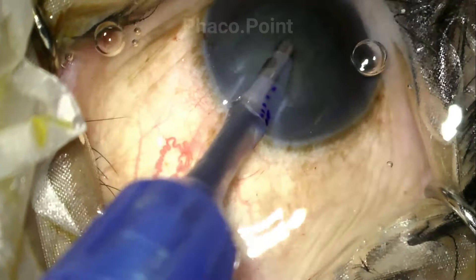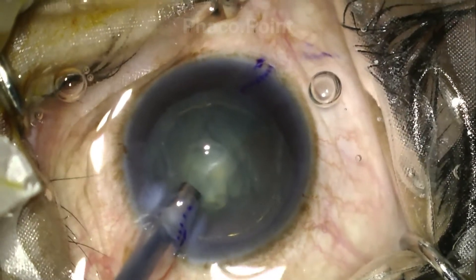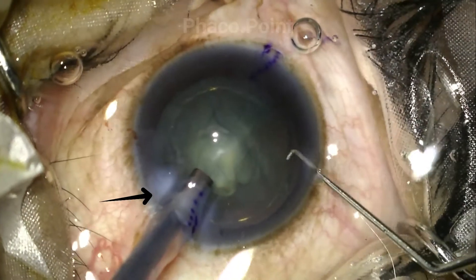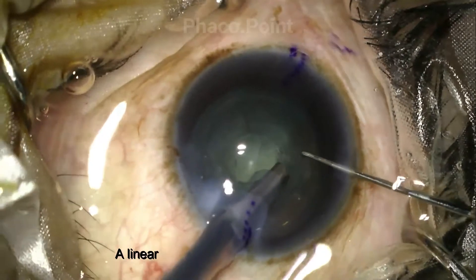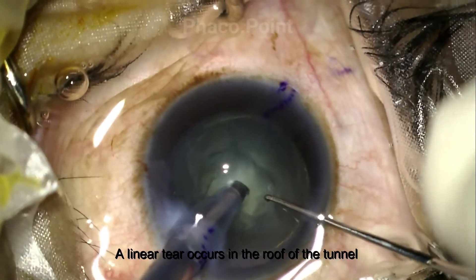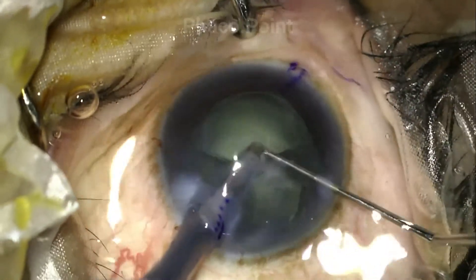We now move to the FACO emulsification. Please do see what happens when the probe is introduced into the eye. There is a tear that seems to be occurring, which as the FACO starts you will see is progressing radially into the cornea. There also is an egress of fluid that constantly seems to be coming from this torn 2.8 tunnel.